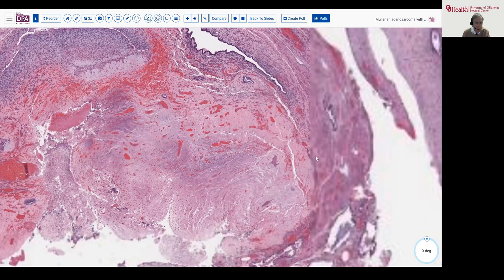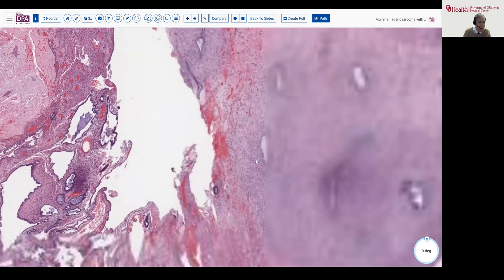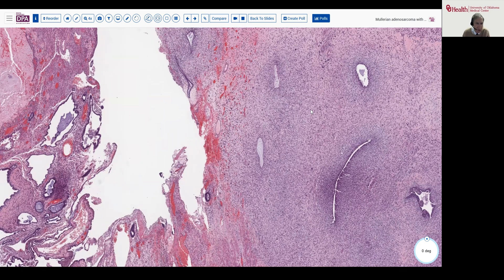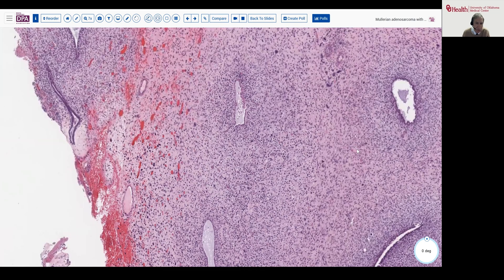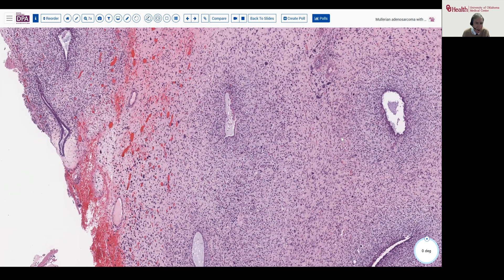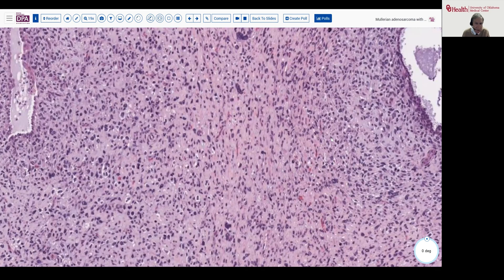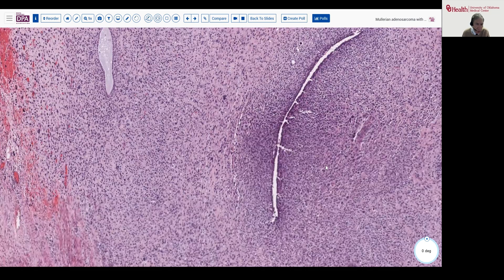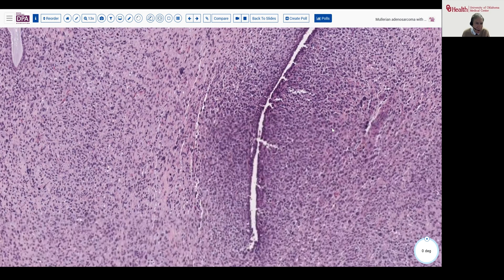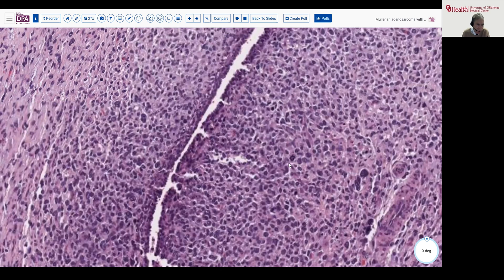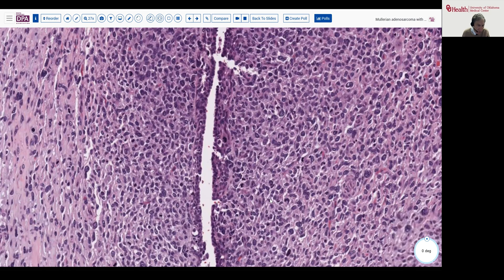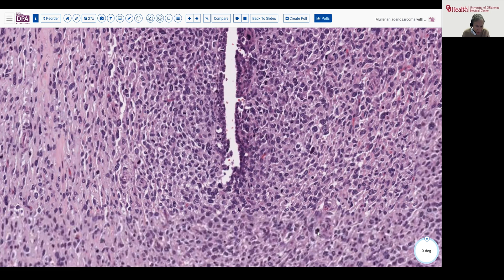We'll come over here to the more high-grade area, the even more bluish area. And here we see, again, stromal atypia condensation around these benign glandular structures, and the beginnings of a more pure stromal proliferation in this setting. Again, we see mitotic activity and low-grade atypia. Here it's becoming even more cellular, and we begin to see some atypical mitotic figures in some of these areas. Here, another mitotic figure. Some tripolar variations, and certainly rounded ones. So, quite a bit more mitotically active in this setting.